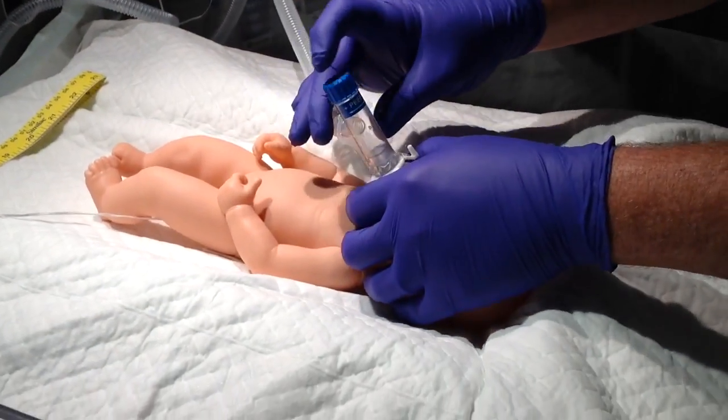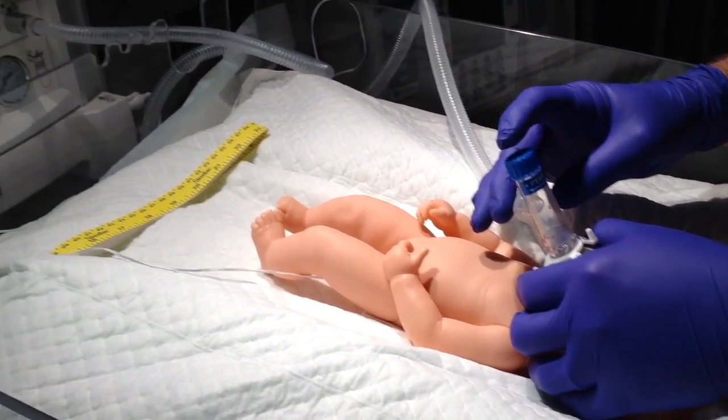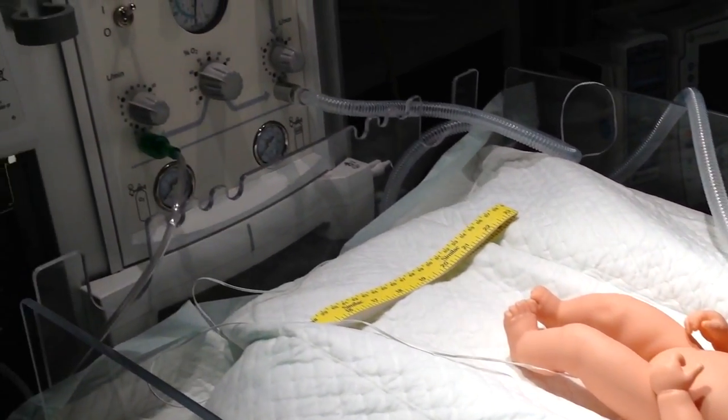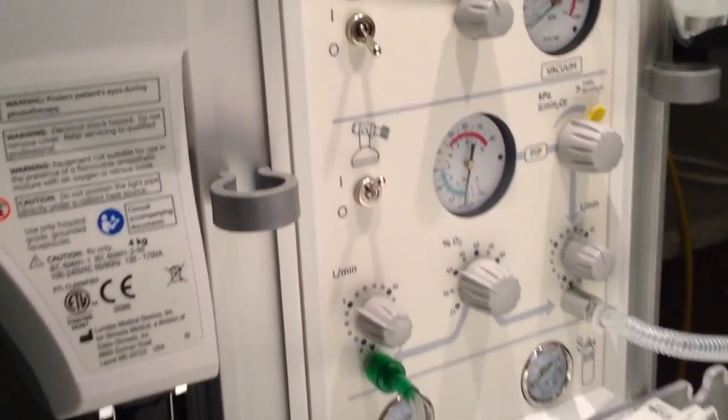Place the mask on the baby's face and initiate manual breaths with your finger. As you can see, as you're doing your finger, you can look up on the gauge and it's going to be a regulated pressure every breath.